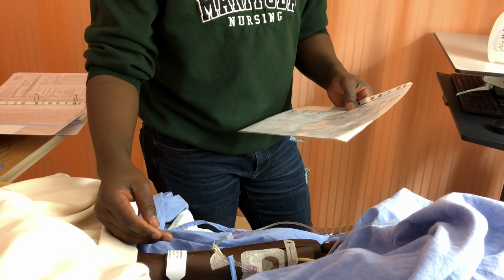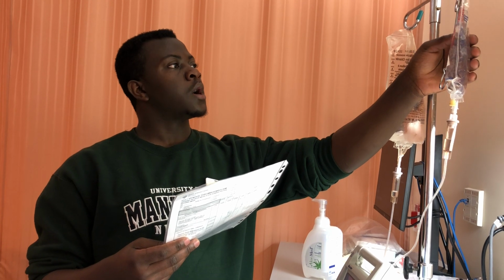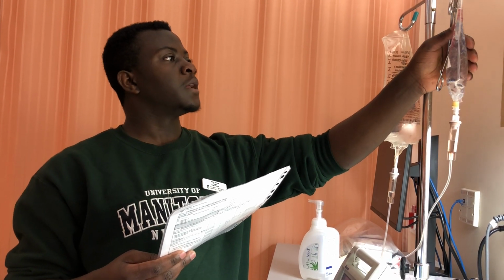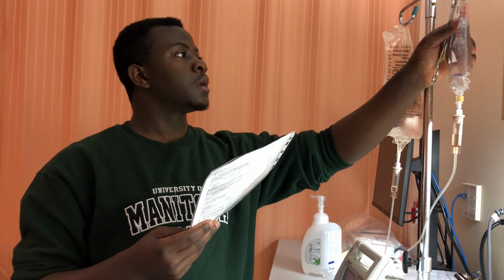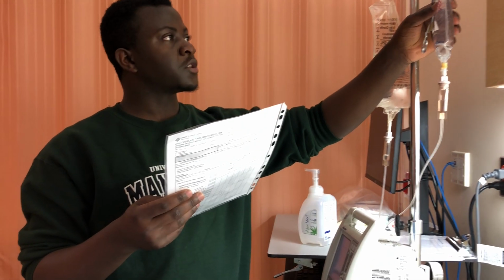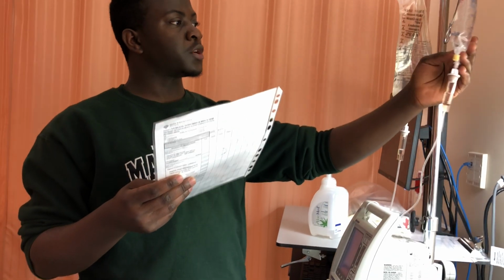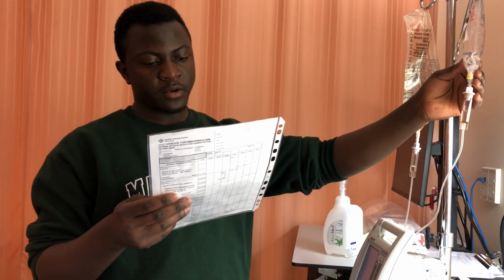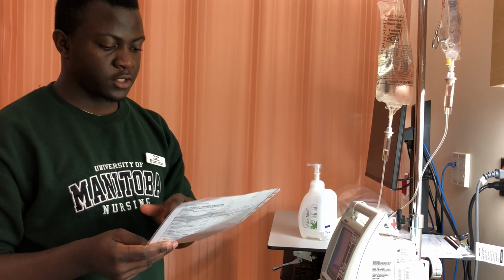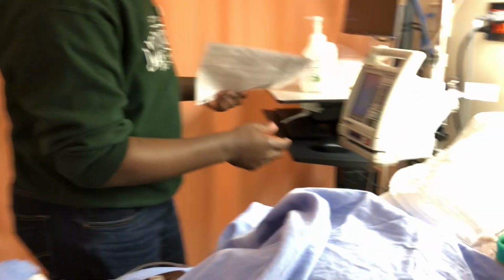So starting by making sure that it's the right patient, we'll check Homeless, Wendy and the PIN number, and make sure it's the right medication, and go through the MAR and the bag: heparin in 5% dextrose, and it's 25,000 units. Final concentration is 100 units per ml, and the final volume is 250. Make sure it's not expired, and it will be going in at the rate of 1350 units per hour. So that's the rate at which I will be setting in the pump.